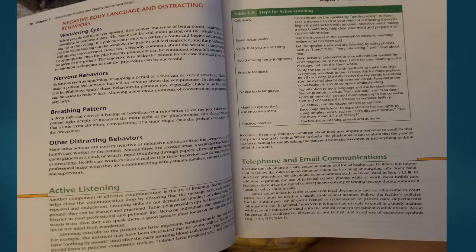Allowing an extra moment of conversation or preparation may help. Breathing pattern. A deep sigh can convey feelings of boredom or reluctance to do the job. Likewise, if a patient sighs deeply or moans at the mere sight of the phlebotomist, this should be a cue that a little extra attention, conversation, or a smile might ease the patient's reluctance for the procedure.